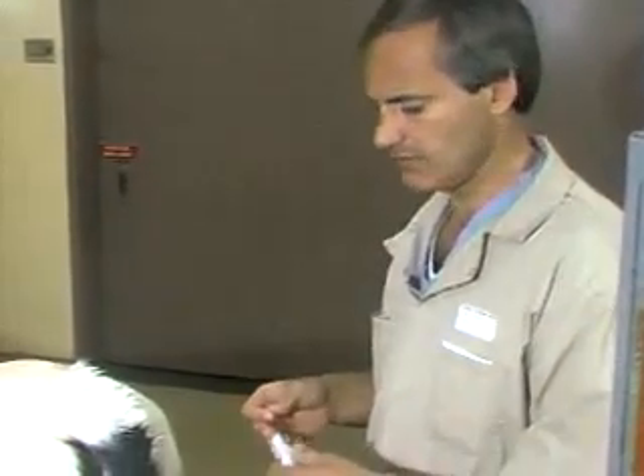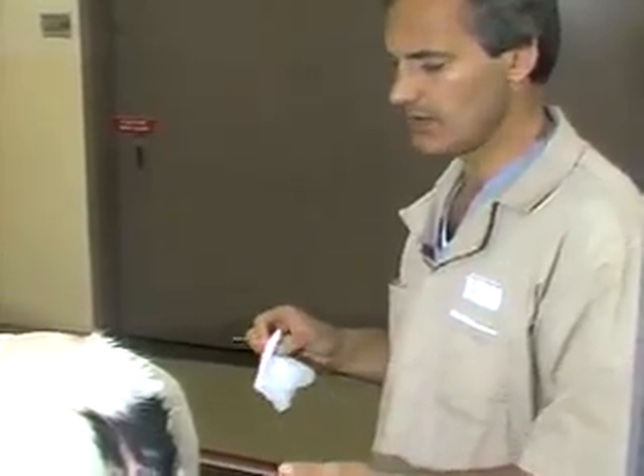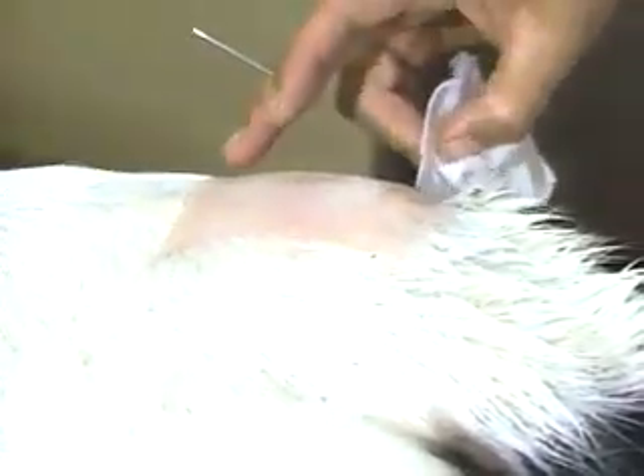Now I'm going to demonstrate epidural anesthesia. This is a very commonly used technique in cattle practice and has many, many uses that I won't go into here. The first and most important aspect is to be sure that the site for epidural injection is thoroughly cleaned. It's best if it's clipped or shaved, and the site we would like to use can be appreciated here when I move the tail — between the sacrum and the first coccygeal vertebra, or as an alternate, between the first and second coccygeal vertebra.